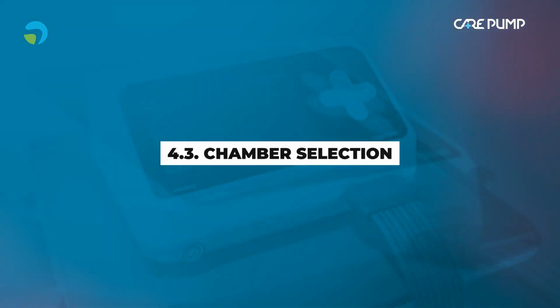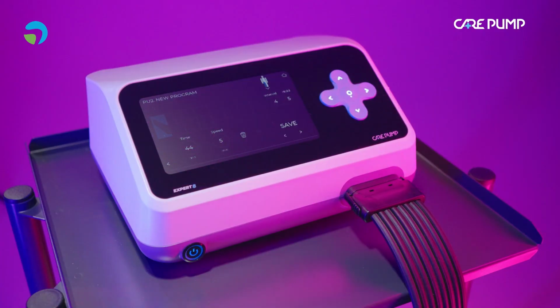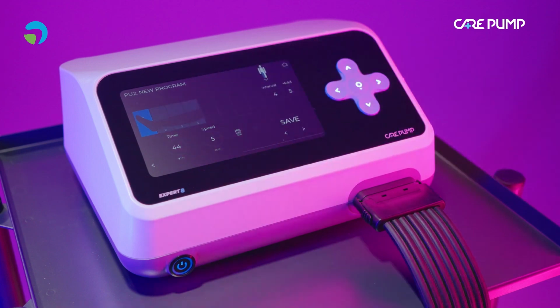Chamber selection. Select the chambers that will inflate during each treatment cycle. Press the field with the number of the particular chamber. After pressing, the field will be highlighted in blue, which means that the selected chamber will be pumped in a given sequence. To program more than one chamber pumping sequence, press the right arrow and select which chambers should pump in the next cycle.